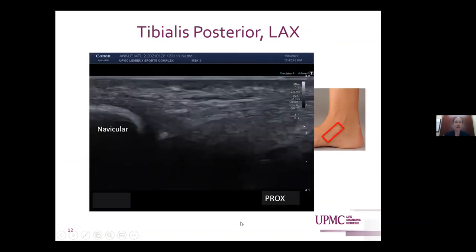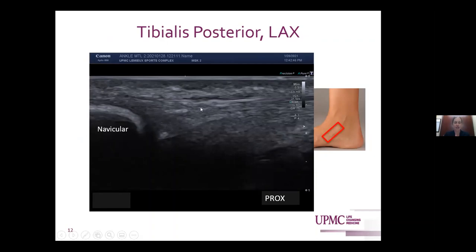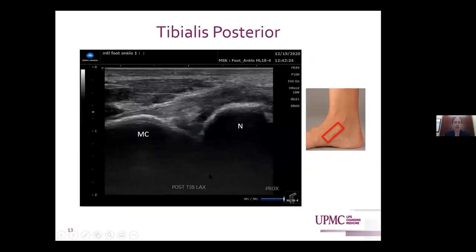Moving on, we can see the tendons in long axis. Looking at tibialis posterior, it has a broader insertion onto the navicular before continuing on to its insertions on the medial cuneiform as well as the second through fourth metatarsals. It is normal for it to appear a little bit broad, thickened, and slightly hypoechoic prior to its insertion on the navicular, with a little loss of fibrillar pattern as those fibers diverge toward the medial cuneiform and second through fourth metatarsals.